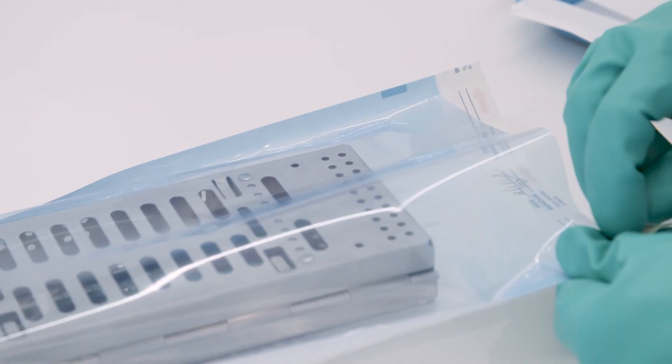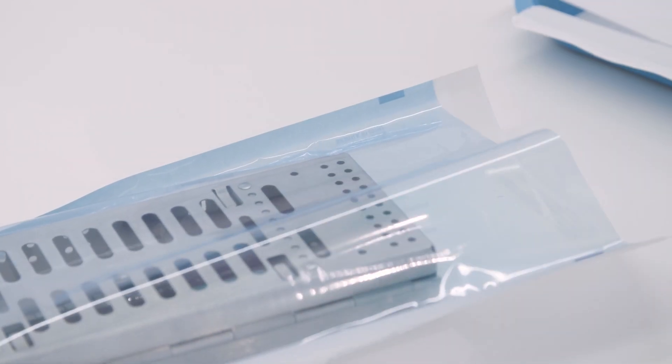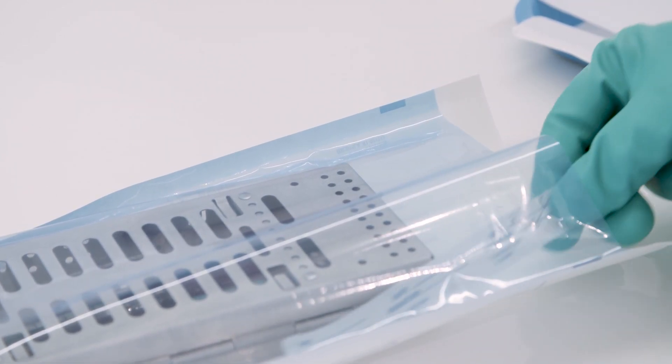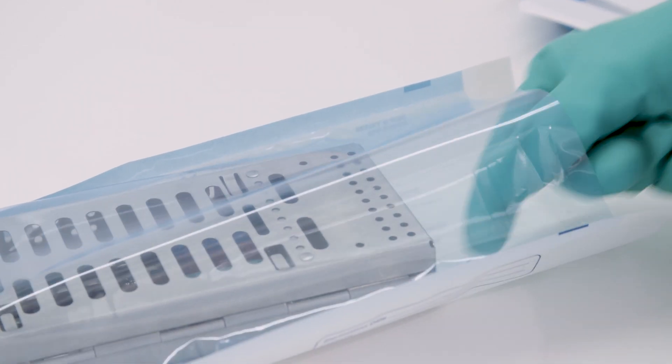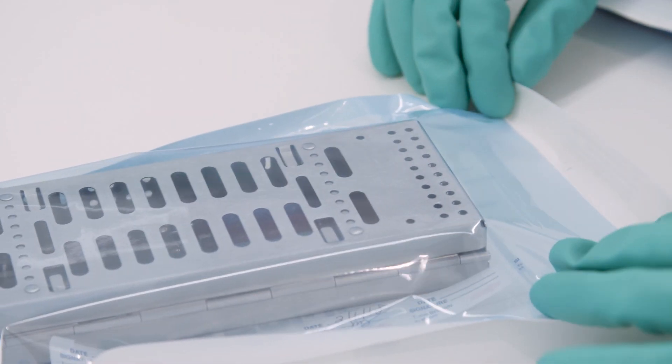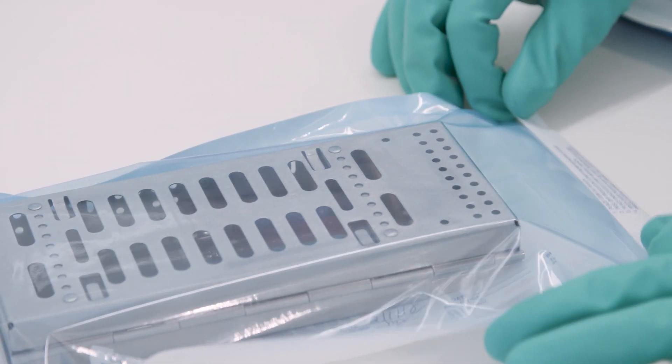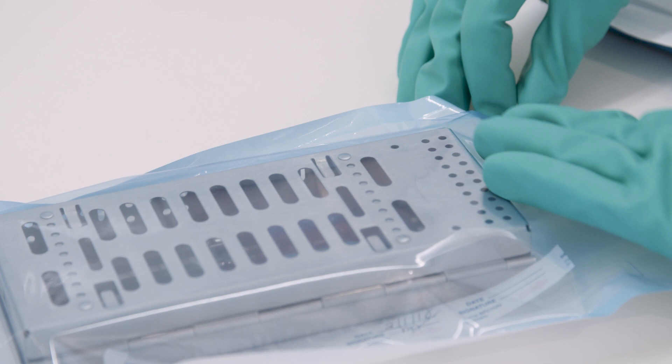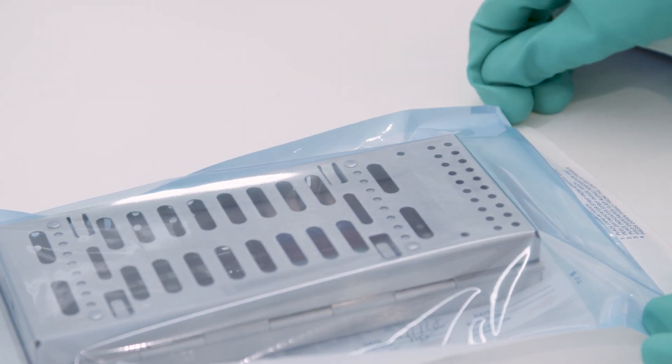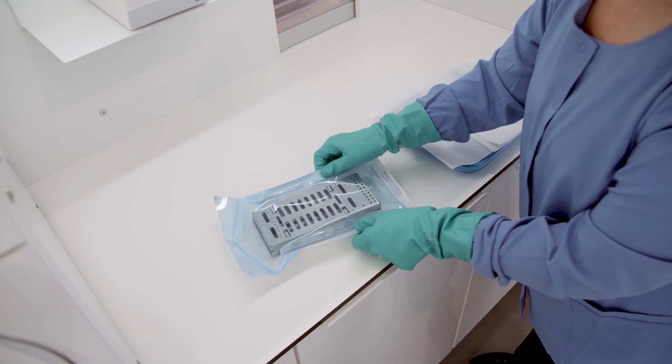The Assure Plus sterilization pouches come with a peel-off strip, which has a Centers for Disease Control recommended class IV internal indicator. Simply fill out the strip, peel it off and place it in the pouch with your instruments. Carefully fold the panel flap along the perforation to create a tight seal.